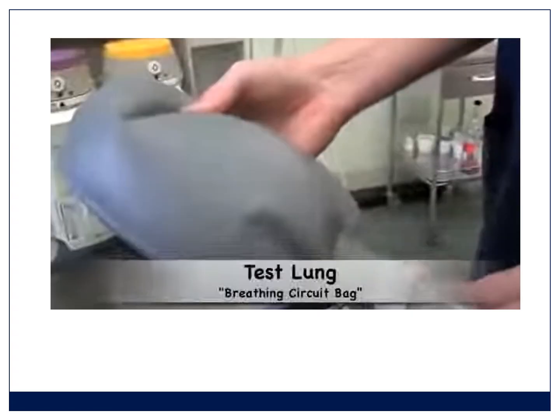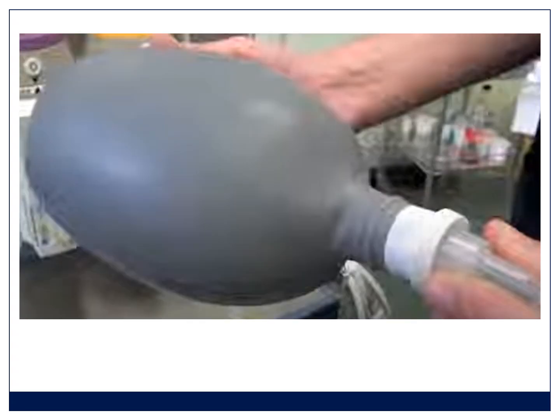Then you want to attach a test lung, and a test lung is just another bag that you stick on the Y piece. So you put the bag on the Y piece, you close the APL valve, turn up the air oxygen rotameters, and you make sure that you can pressurize the system. Then you turn on the ventilator and you ventilate in the mode that you want. So put it on volume control, once that circuit is pressurized, you should be able to turn the gases right down to minimal flows, and then you ventilate with the mode that you're going to use on the patient.